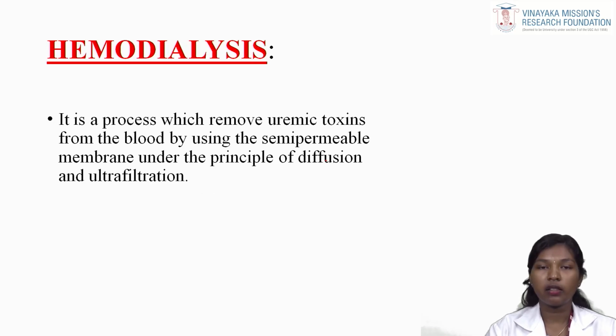What is hemodialysis? What is dialysis? Dialysis is nothing but the removal of substances and waste products from the blood. In today's class we are going to learn briefly about hemodialysis.